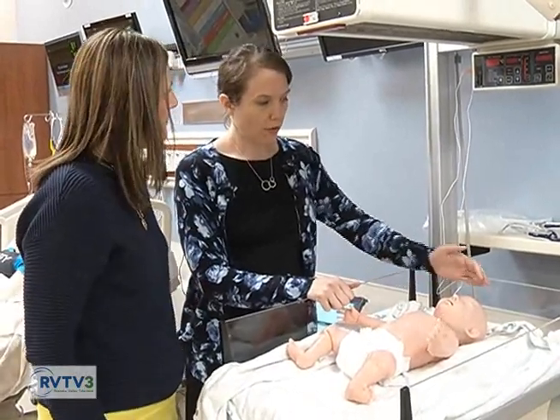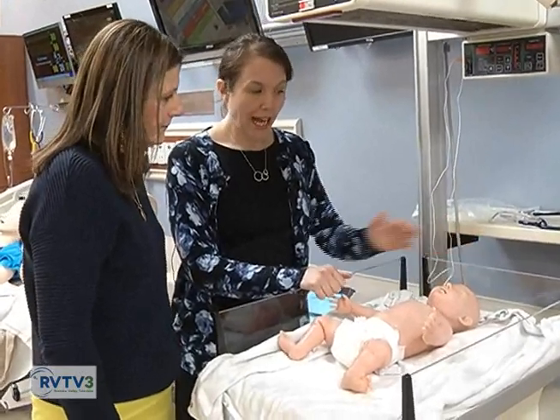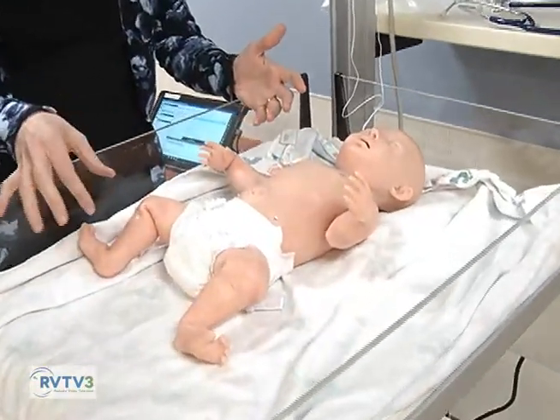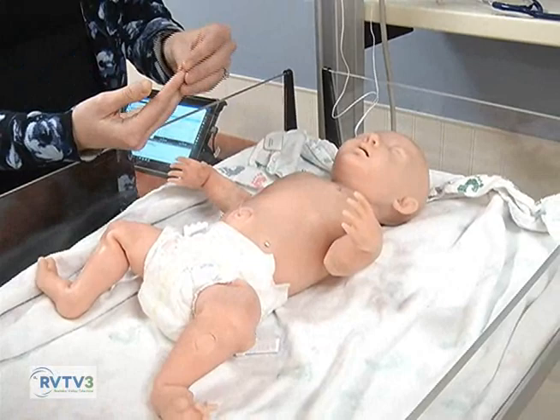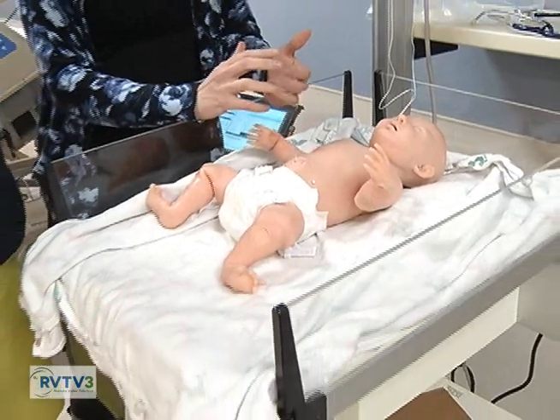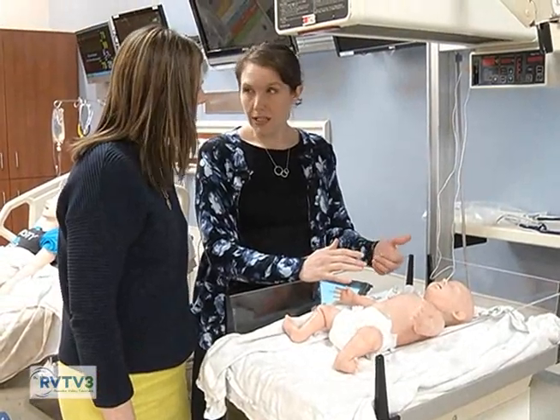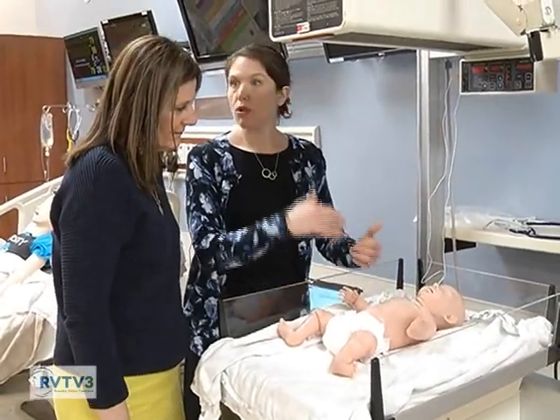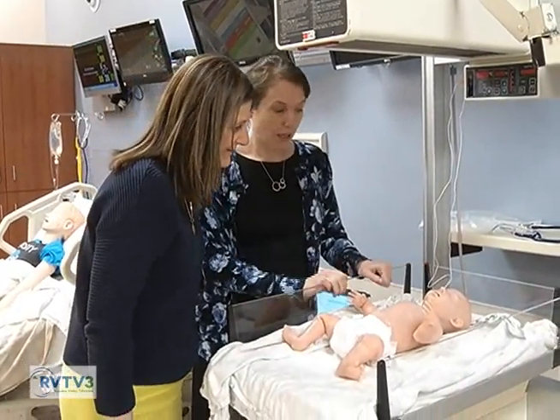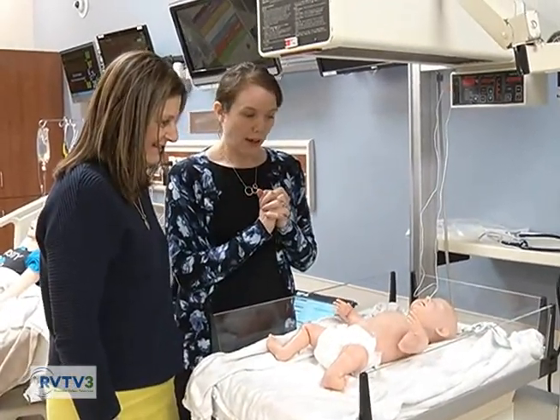She can also do typical issues with little babies. So for example, when they have the issue with their fontanelles, we can replicate that. She can also do things like jaundice. We can look at capillary refill. So for example, if you squeeze her, you'll see that her skin will go white and then come back. All of these things are really great technological innovations because not only does it help increase the realism for the learners, but it also shows them here's actually physiologically what happens with a baby when you do different kinds of interventions with them. So she's an amazing piece of technology. Yeah, we are really excited to have her part of our suite of tools here.